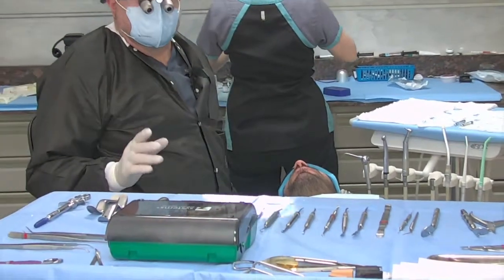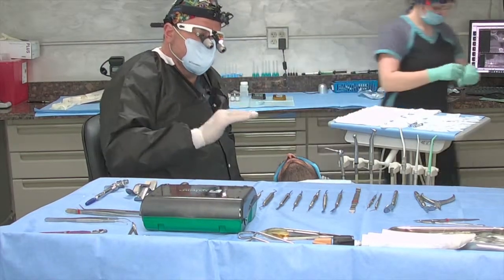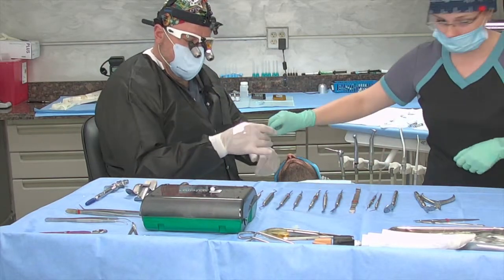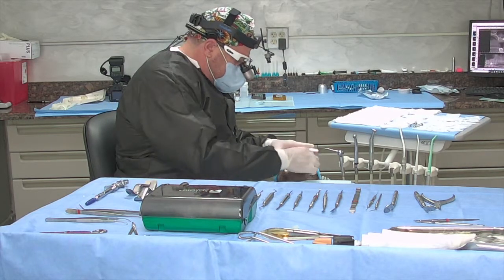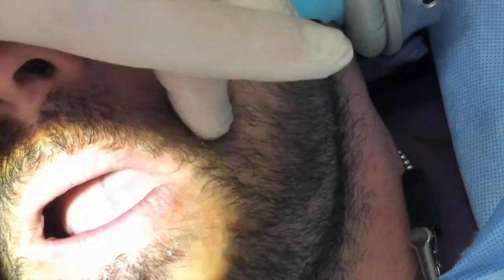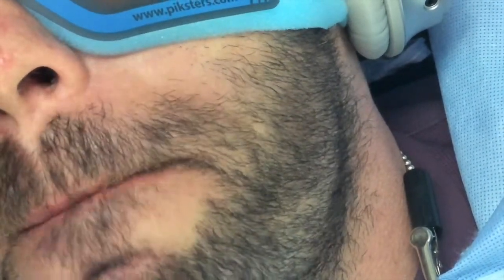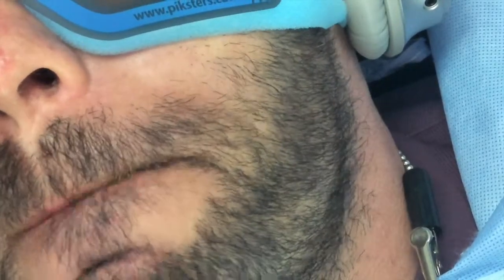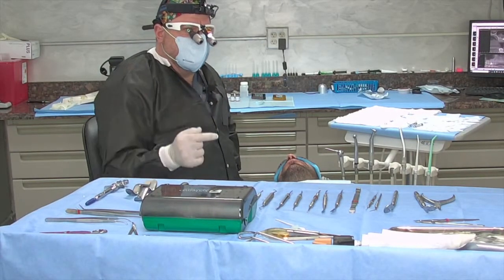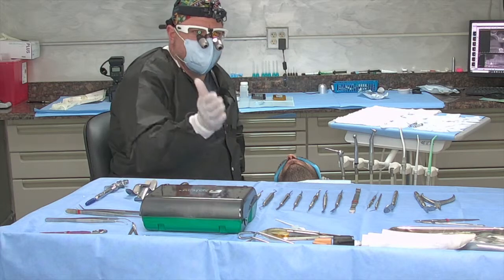Yeah, good. So it'd be really interesting because I didn't do the graft, but it was done several months ago. And we've lost some tissue and a little bit of the height of the ridge. So I'm going to start it off with a minimally invasive approach, of course. And then what I'm going to be doing is using the internal aspect of the crest to plump the buccal tissue on the facial of the implant. So it's kind of like what I would do in an immediate extraction socket, although I'm going to do it internally, and decide with the width of the implant whether I'm going to add the graft or not. I don't know at this particular point.